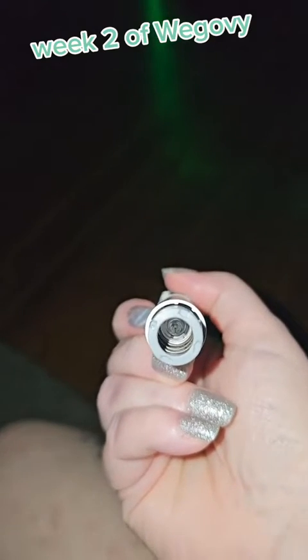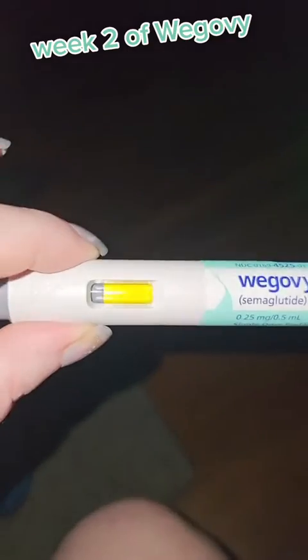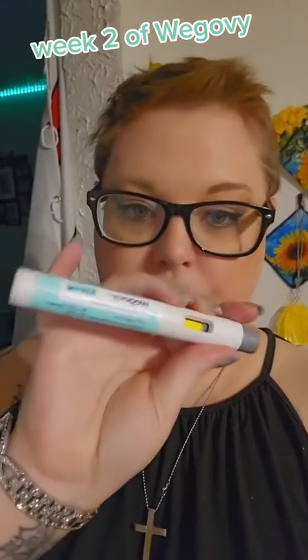But you can't feel it, so let's do this. This is what it looks like once it's done — you just push it into your skin. You can see that I pushed it right there. So you hear one click, and then you will hear two clicks, and then you wait for the window to turn yellow.